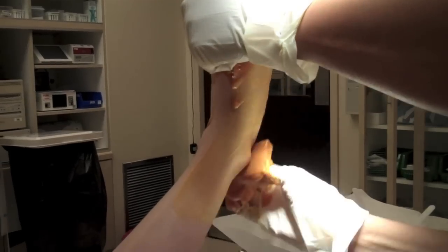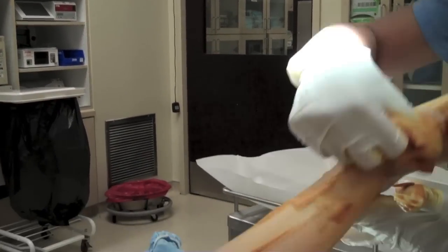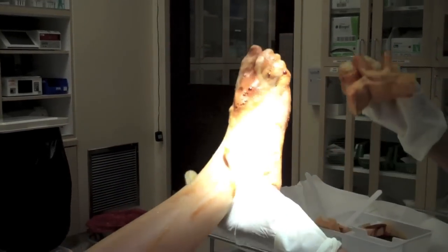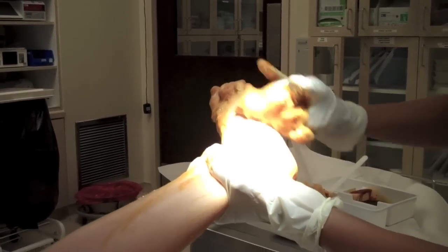Now that I've lifted his foot, I can't let it down — I've got to keep it up. Now those drapes are dirty and contaminated. Always start at the incision site, so I'm going to scrub there pretty good because he's going to make his incision here.